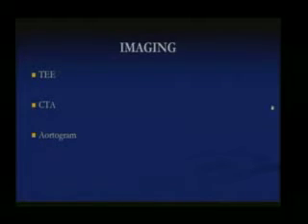You can see the intimal flap, you can see the dissection, you can see a local rupture, a contained rupture. Then obviously the CTA, nowadays this is the gold standard to diagnose thoracic aortic injury. Then comes the aortogram. The aortogram per se does not take time to do, but getting everything set up is a big deal. And the other thing is it's an invasive procedure, and sometimes you can miss a localized injury on the angiogram that you would see on the CT scan.